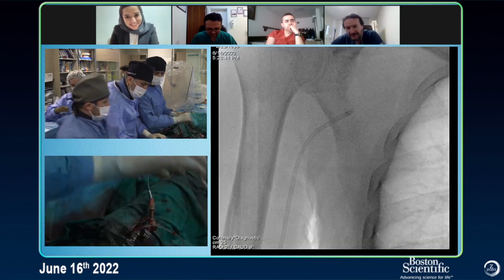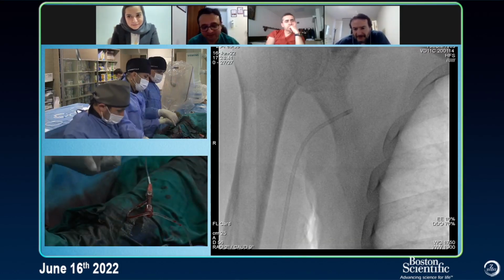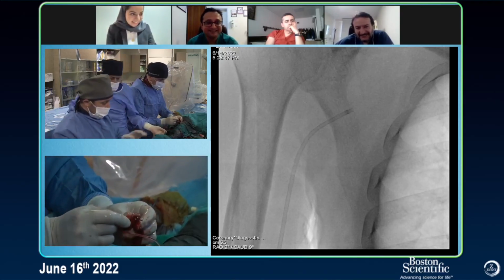Wire. The final chef got some excitement. Yeah, I'm very happy. Looking like a very dull case.